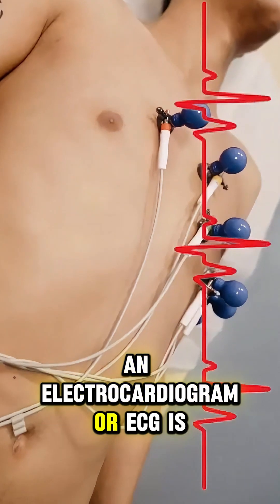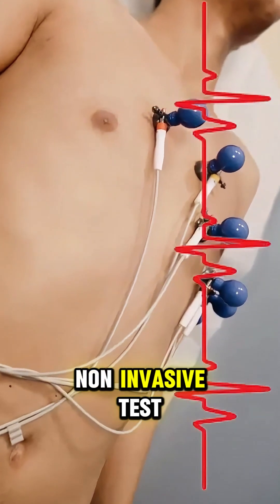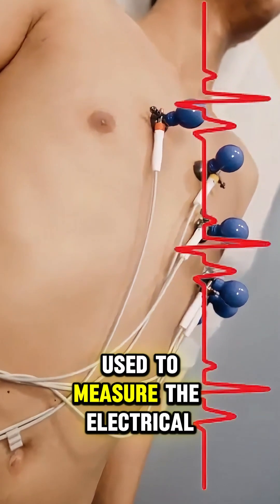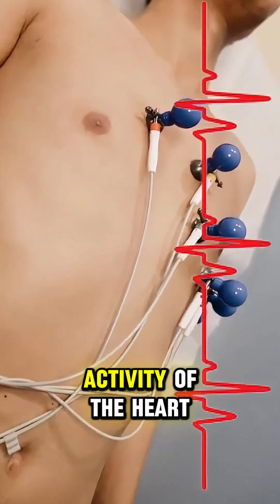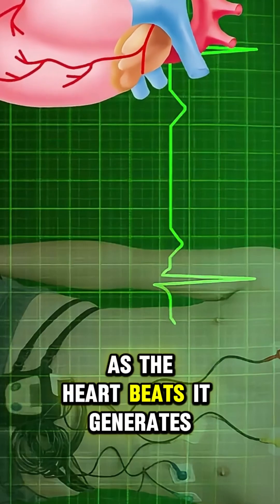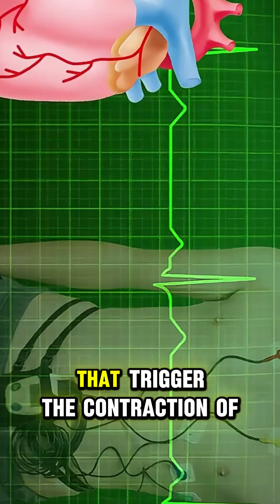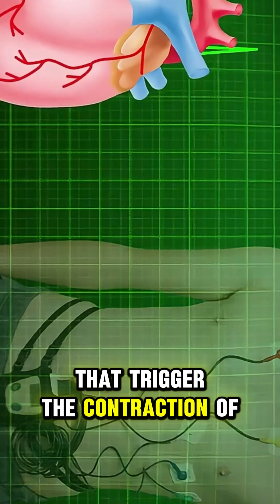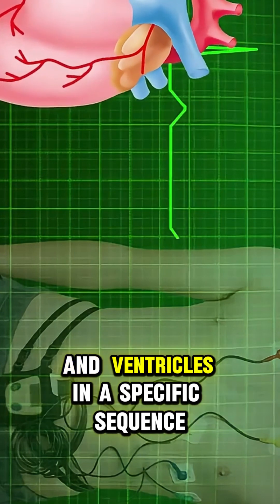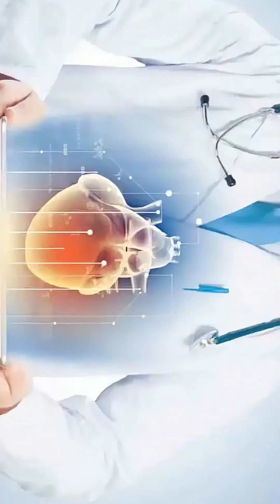An electrocardiogram, or ECG, is a simple, non-invasive test used to measure the electrical activity of the heart. As the heart beats, it generates electrical impulses that trigger the contraction of the atria and ventricles in a specific sequence.